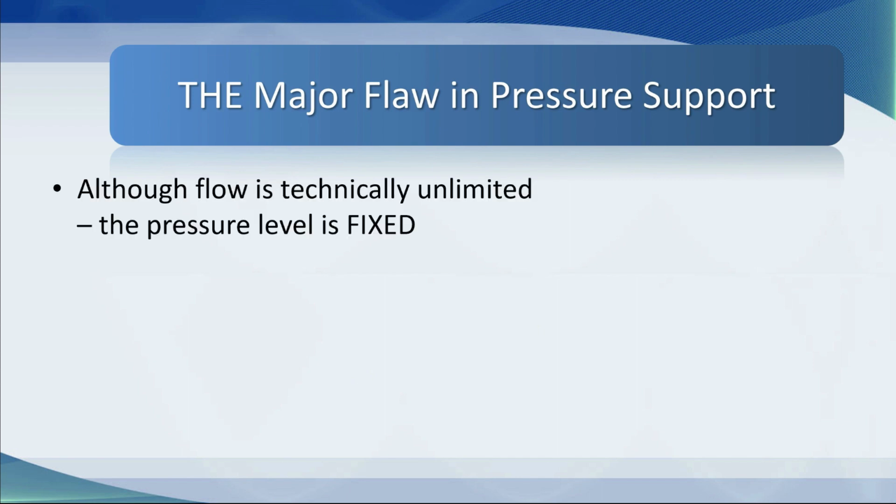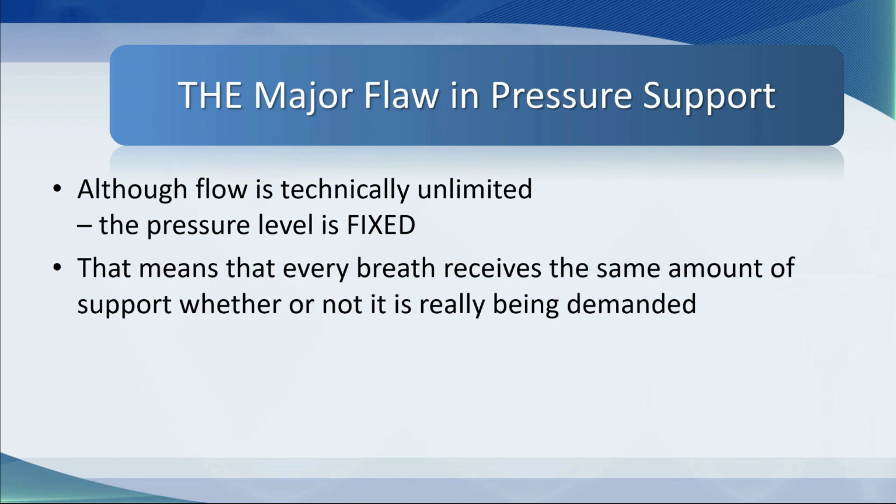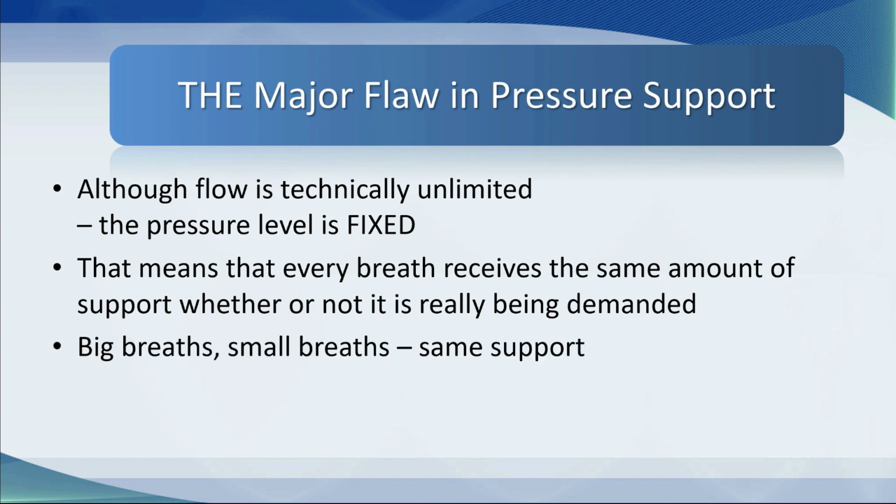Although flow is technically unlimited, the pressure level is fixed, and that means that every breath receives the same amount of support whether or not it's really being demanded. Big breaths, small breaths, same support. Can anything be done about this?